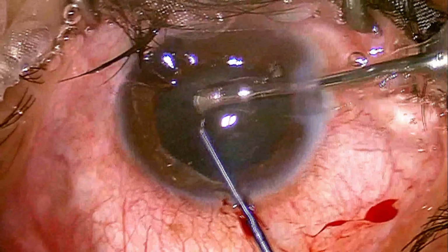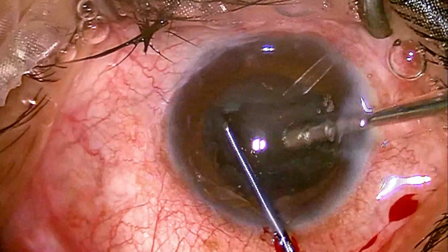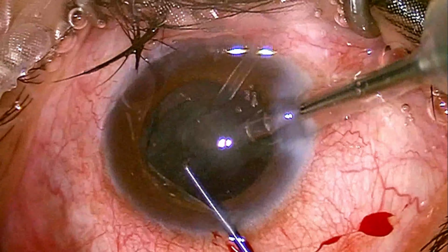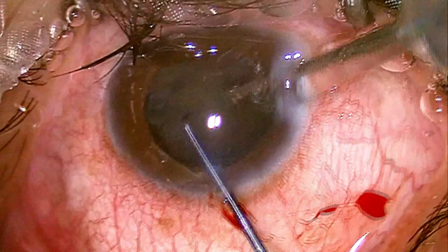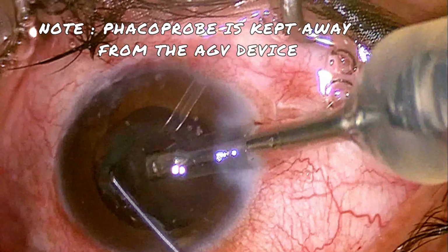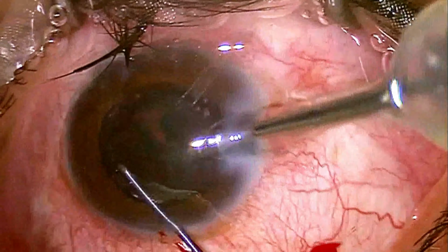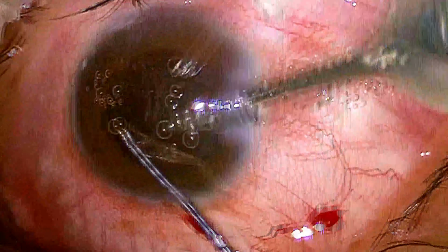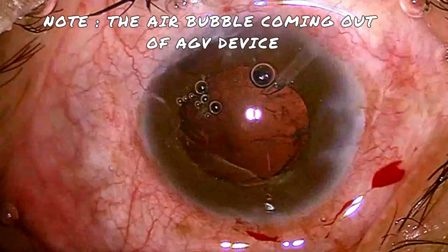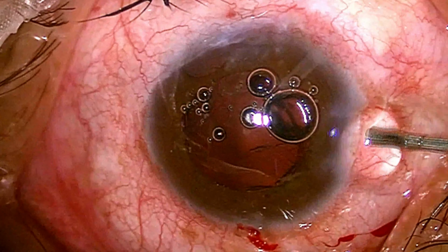We are slowly and carefully removing the cataractous lens, keeping in mind that the phaco probe should be away or opposite from the Ahmed glaucoma valve, and minimum handling of uveal tissue should be there. We can also note there is an air bubble coming out of the Ahmed glaucoma valve.